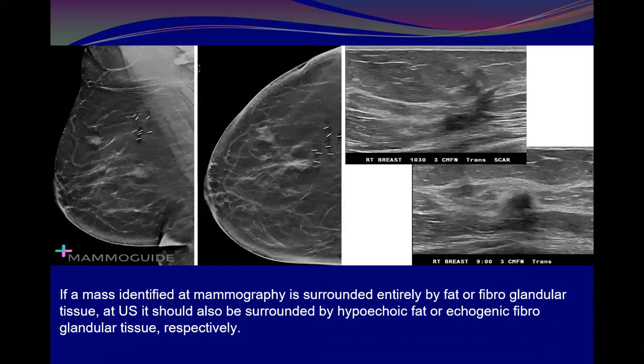Again, this is the fatty breast, and here this is a breast lesion. Good, we have a CC view. So this lesion is central and this one is upper. This one is central, so it is most likely at 9, and this one is a little bit more lateral and upper, at about 10 o'clock.